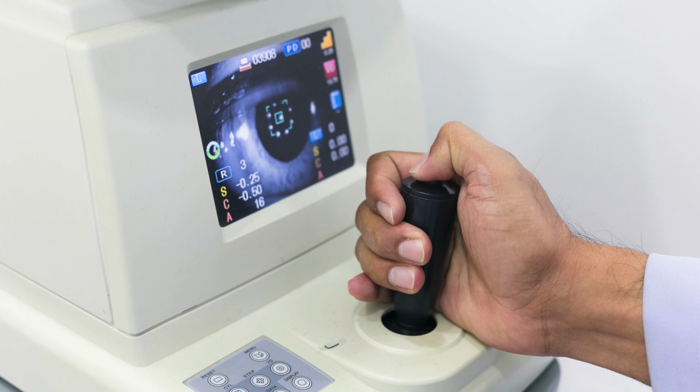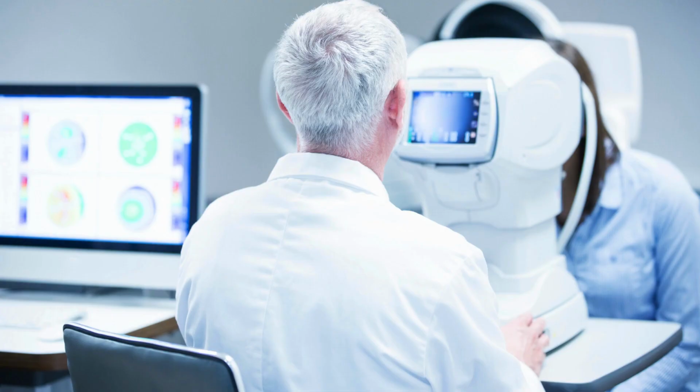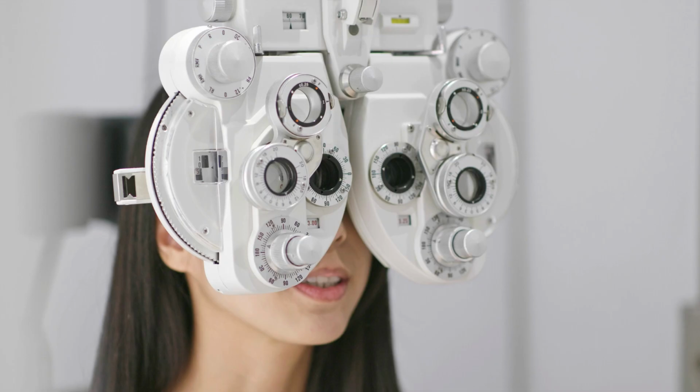There is nothing special to do before having a corneal topography exam. If you wear contact lenses, the ophthalmologist may ask you to stop wearing them for at least 3 days. You sit facing the equipment and position your forehead and chin on the designated spots. The device automatically begins scanning when you focus on a target light, transforming the data into color-coded topography maps on a computer screen in just a few minutes. Your eyes remain untouched during the entire procedure. The corneal topography procedure is akin to a photo shoot for your eyes. Therefore, it is safe and carries no risk.